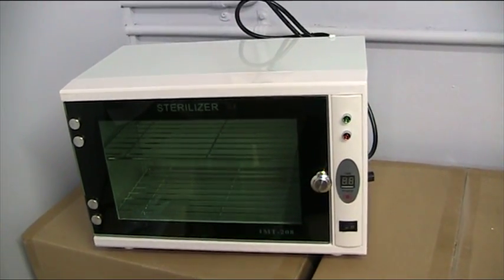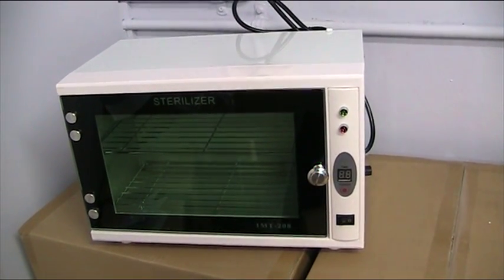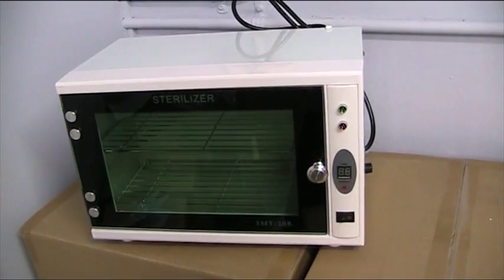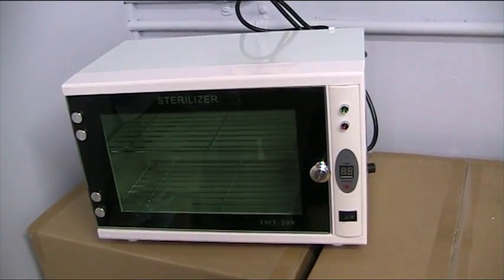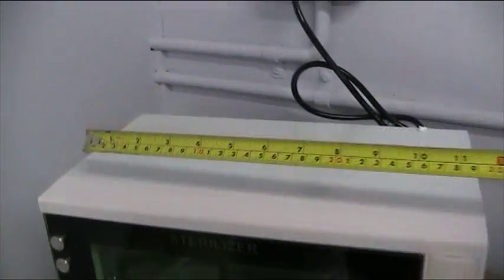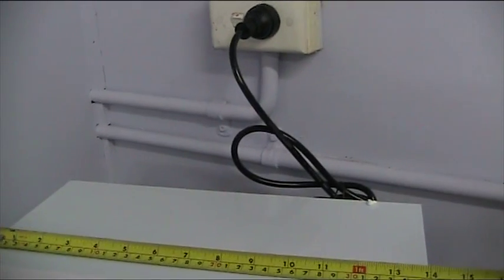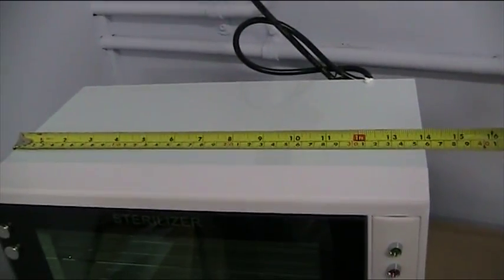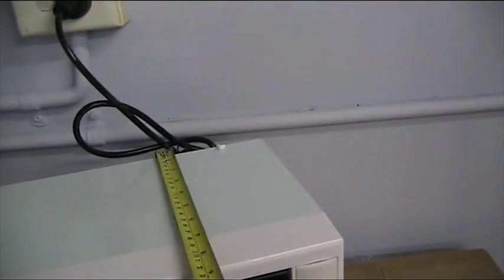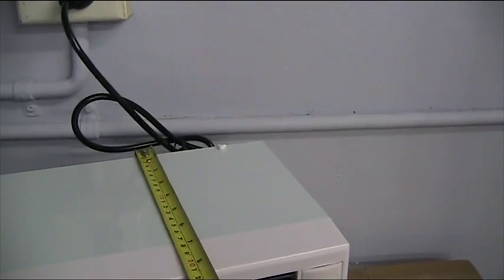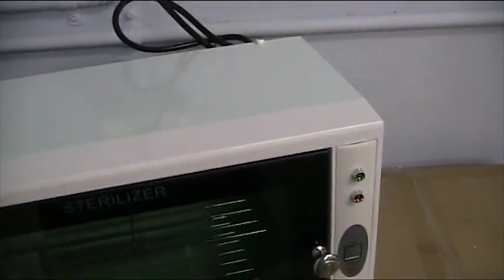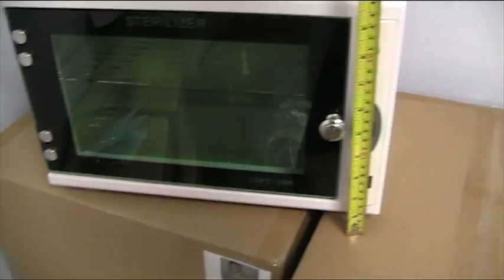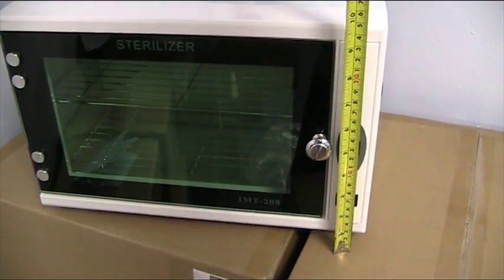This item is the 1MT208 sterilizer unit. The outside dimensions for this unit are 35cm wide, 23cm long, and 25cm high.